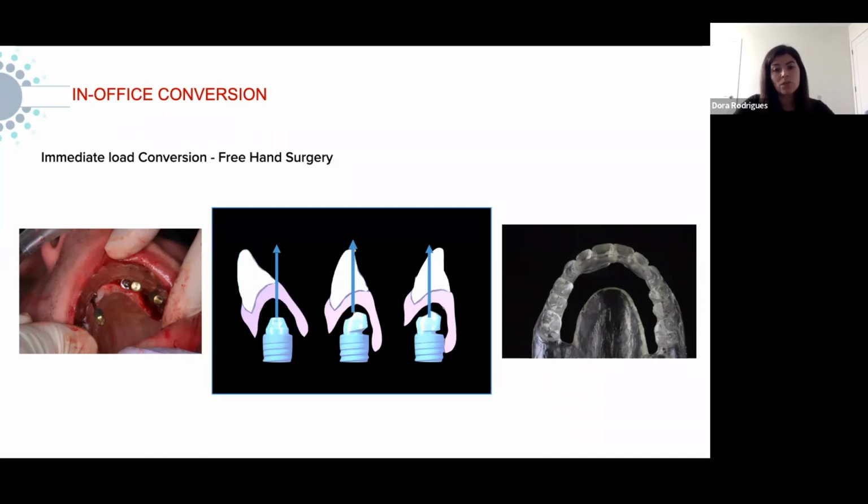And if that tooth position was not planned properly, we run into issues down the road. So this is just an example of the different multi-unit selections that we have. If we have the implant placed and you see that the screw axis is already on the lingual of the teeth, that's fine. We don't need to correct the orientation. That position is great.